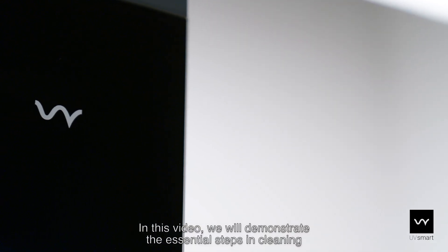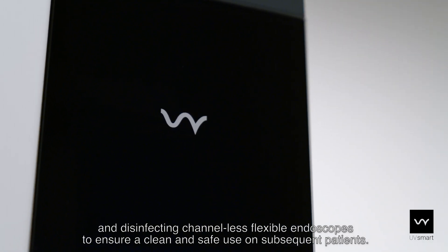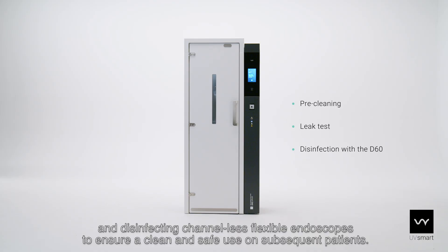In this video, we will demonstrate the essential steps in cleaning and disinfecting channelless flexible endoscopes to ensure a clean and safe use on subsequent patients.